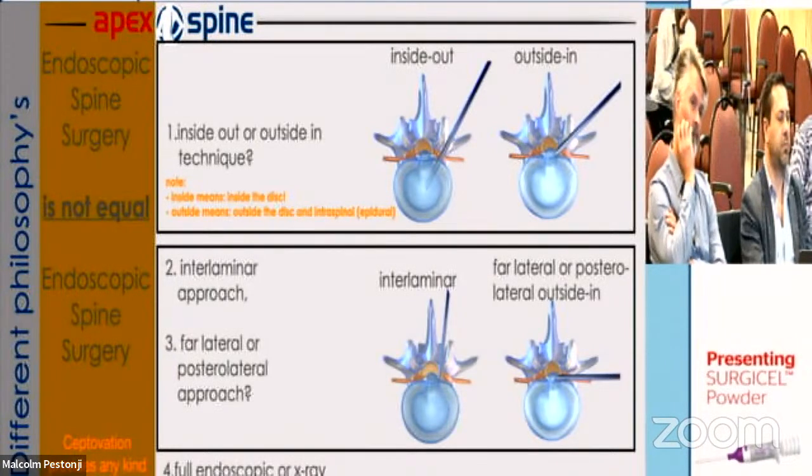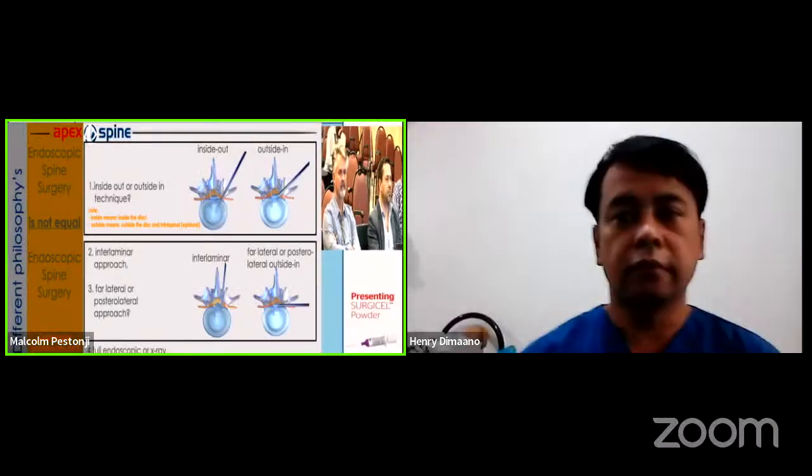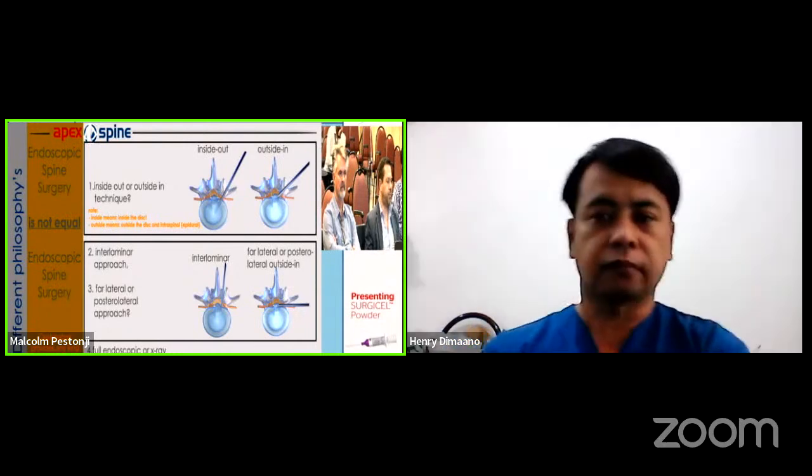I have a different philosophy. My philosophy is outside-in. That means I stay outside the disc, in the spinal canal first, to treat and to remove, for example, disc herniation and see the freed nerve. Additionally, if I think there is loose material inside the disc, I can remove it. And then we have an interlaminar approach or a far lateral or posterolateral approach. There are a little bit of differences in the instruments and approach.